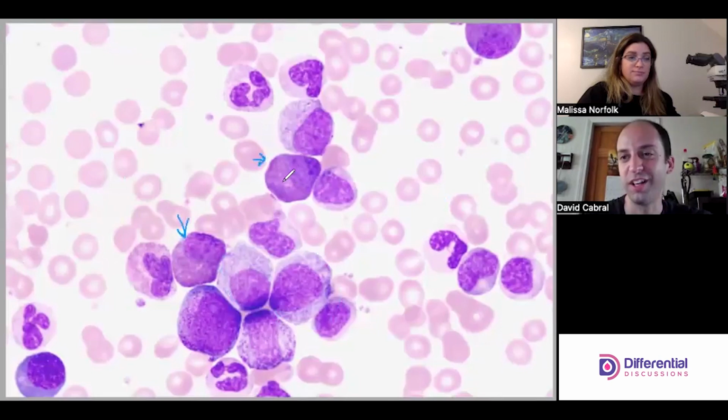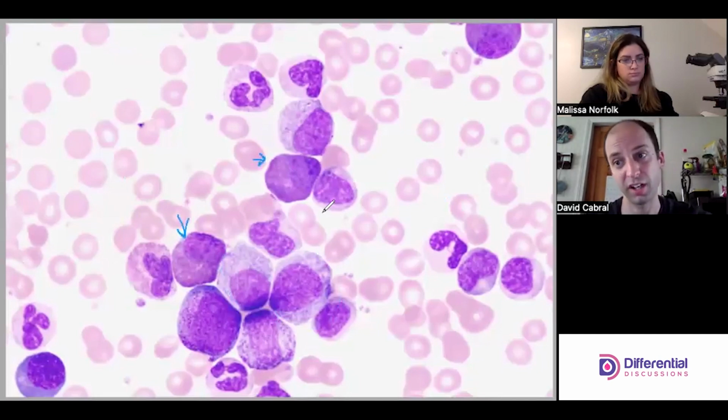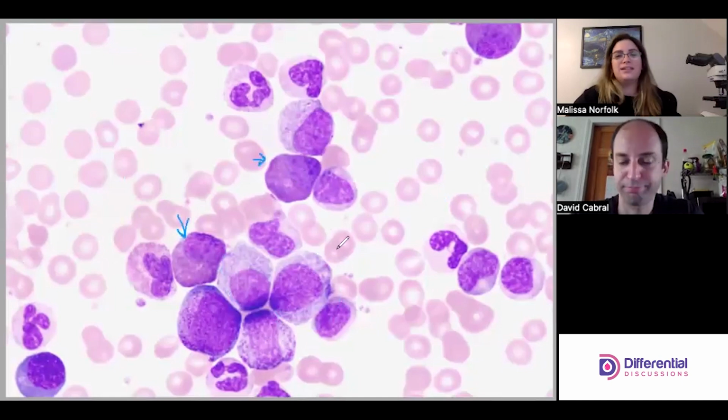True. We can be technically correct and more precise, but is that warranted? I also try to think of how you control this across the laboratory, because having every tech proficient enough to make distinctions like that might be a tall ask. But I just wanted to point out that it was there. Oh yeah, 100%. It's good physiology.